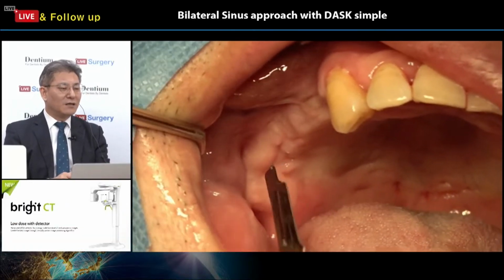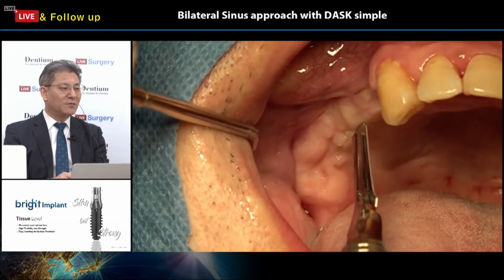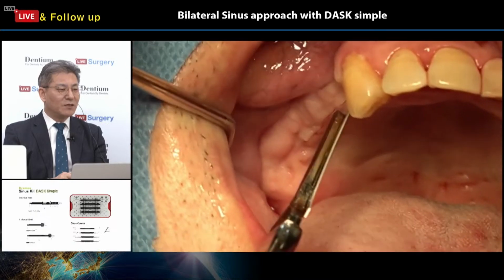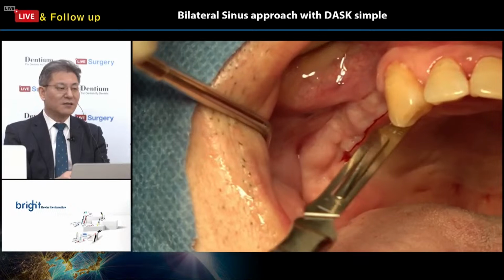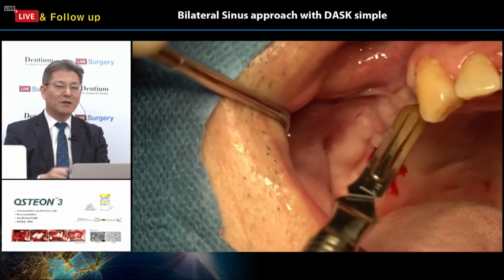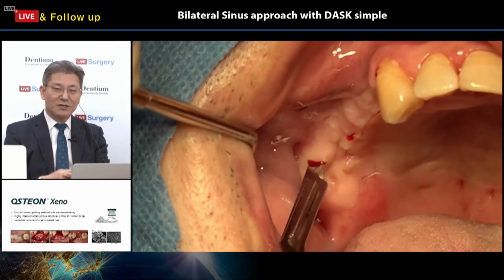Okay, the upper left area was done. Now he is moving to the upper right area. So can you see the crestal incision? As I mentioned before, from the mid crestal, 2 millimeters to the palatal side is better to manage the flap and better for capturing the surgery field.